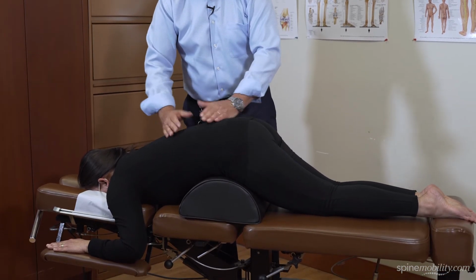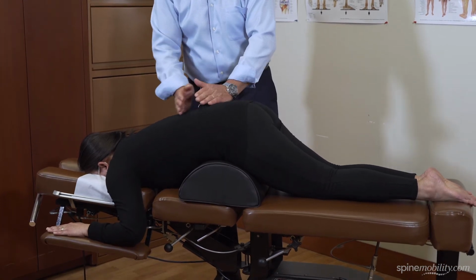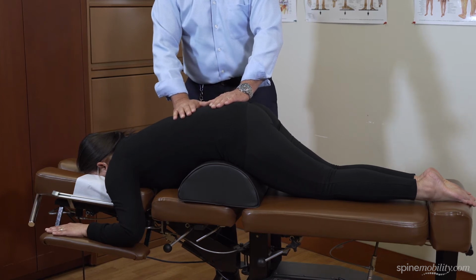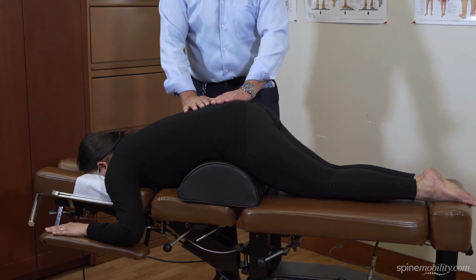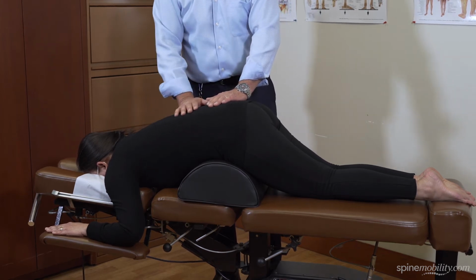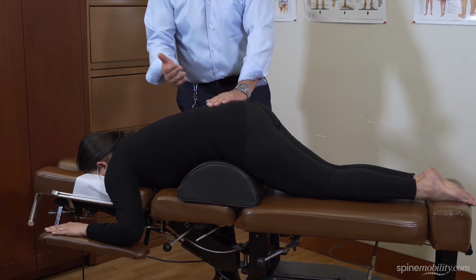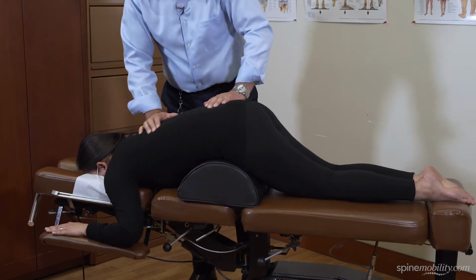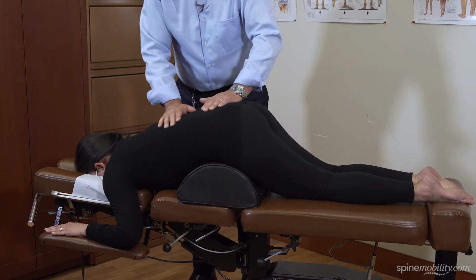This introduces flexion, which maximizes the opening of the spinal canals in spinal stenosis. It also reduces facet imbrication in patients who have facet syndrome or degenerative back pain. It also releases the tension of the sacroiliac joint for patients that have sacroiliac joint dysfunction, and also patients who have far lateral disc herniation. These patients also prefer a flexed position. So that's the preference that these patients have who have all these conditions, and the bolster helps to introduce flexion when providing the treatment for those various conditions.